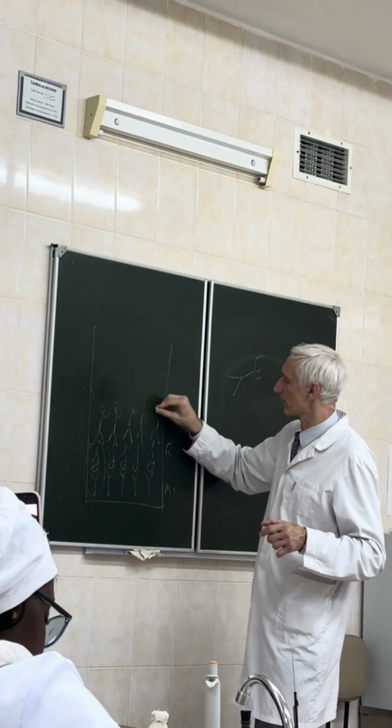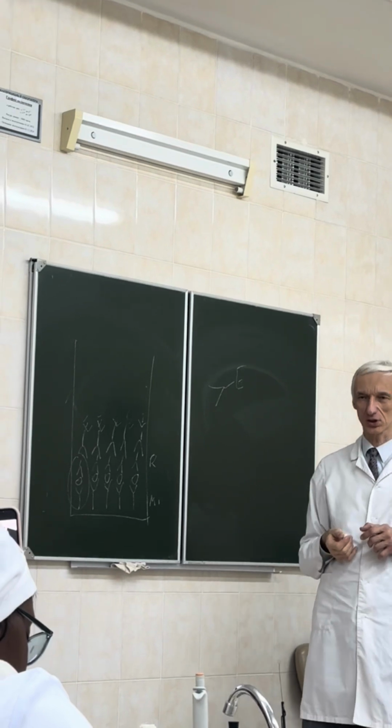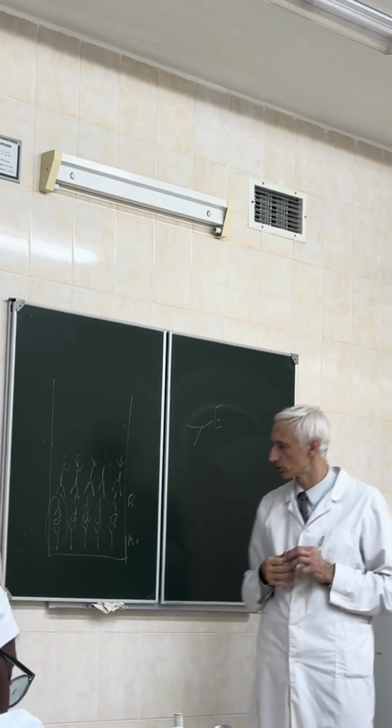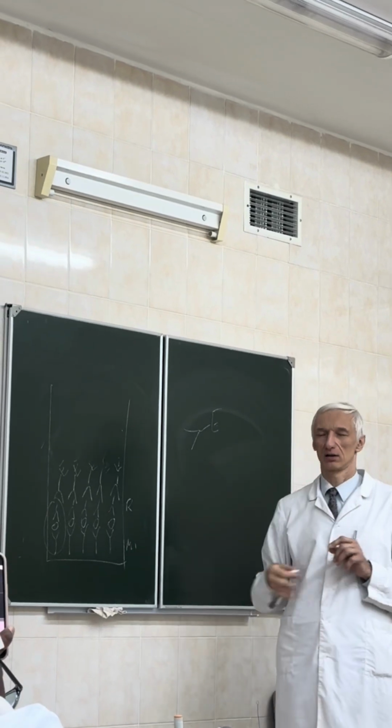So I think everyone understands all the steps. All the incubations are followed by washing to eliminate non-specific binding, because binding might be here everywhere. Okay, so here it is.